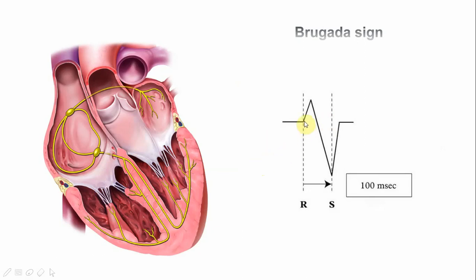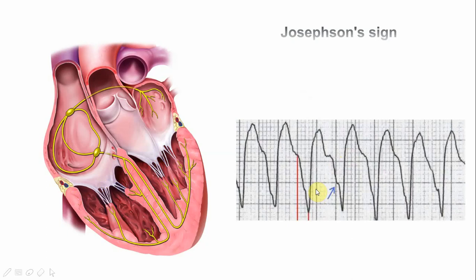Another important characteristic feature is the Brugada sign, which is part of the Brugada criteria. The Brugada sign is measured from the beginning of the R wave to the nadir of the S wave. If this distance is more than 2.5 small squares — which equals 100 milliseconds — this is a positive Brugada sign. In this particular ECG that distance is about 3 small squares, equaling 120 milliseconds.